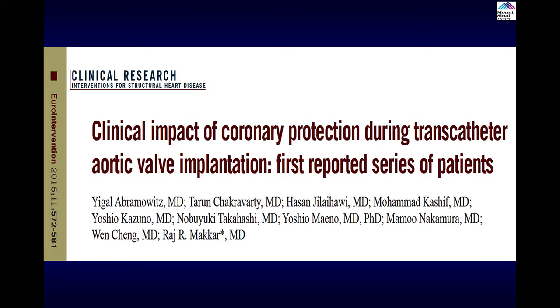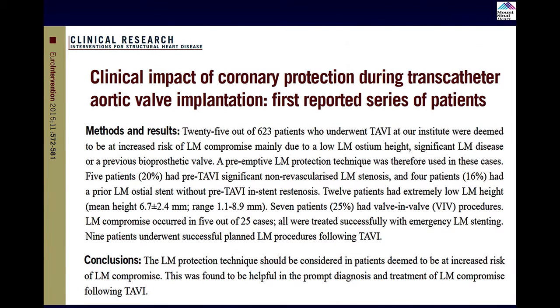And what is the preemptive technique? Next. It was used in 25 out of 623 TAVI patients at their institution, a preemptive left main protection technique. That means you advance a deflated stent into the left main at the time of TAVR. If obstruction of the left main occurs, you pull it back and deploy it at the ostium.